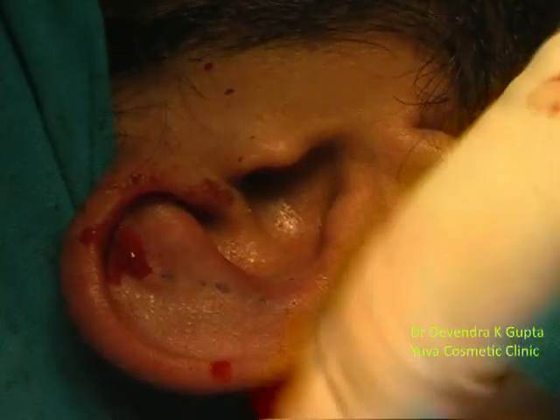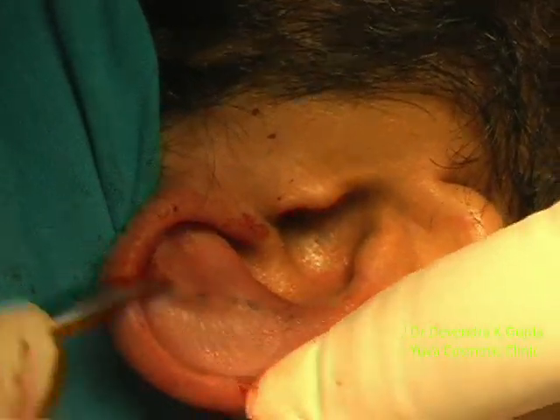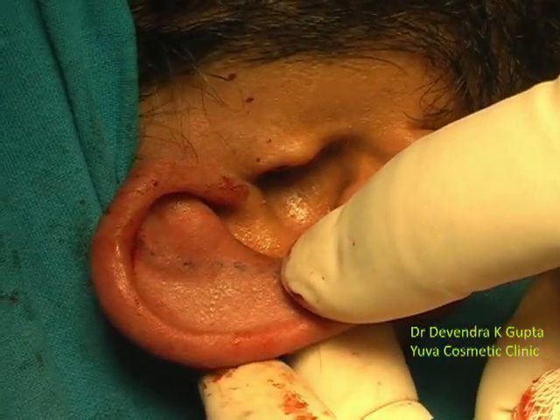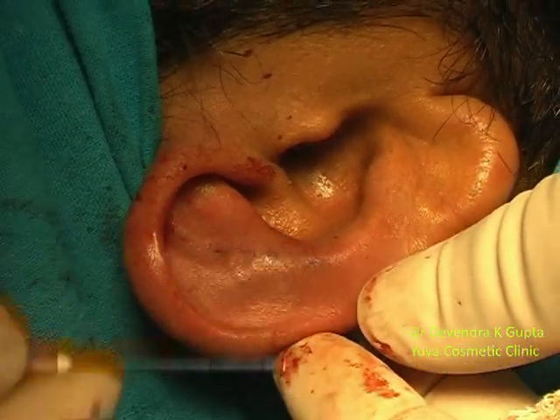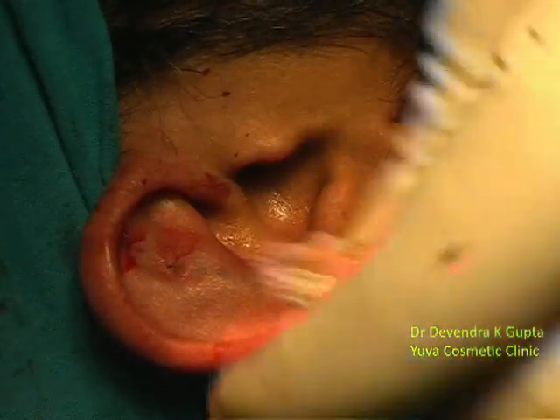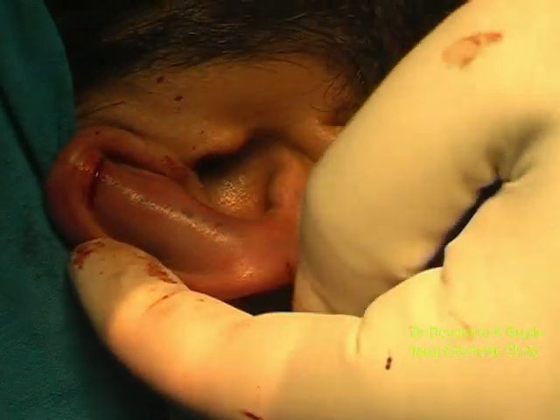You can notice the scored area here. This is the scored area, and this part is broken with the help of a 20-gauge tip like this, to weaken this area. We have already scored it with the help of a motorized diamond abrator so that it can be bent like this.